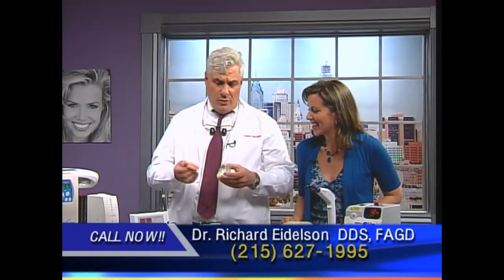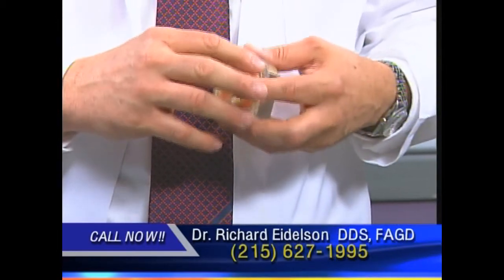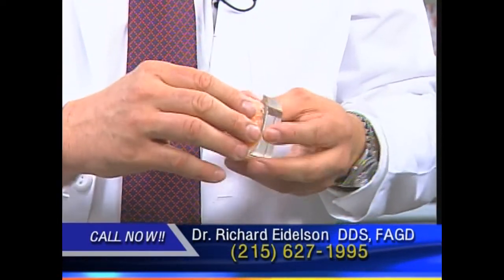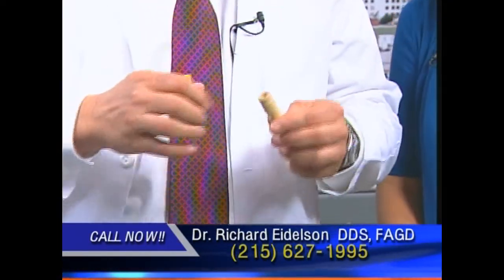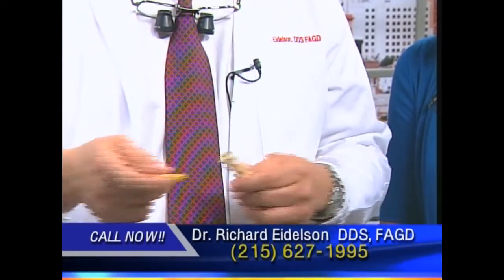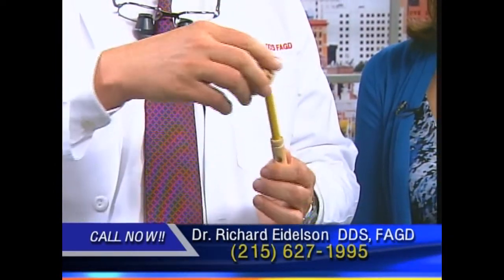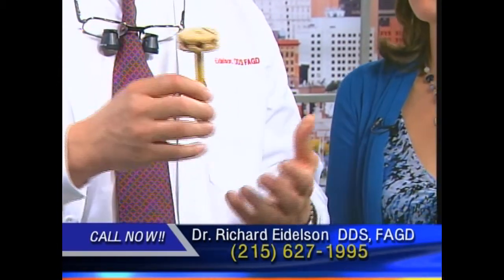Now, you have this here, and you're not going to tell me that these Tinker Toy pieces are part of your latest and greatest technology, are you? Well, we were talking about implants. It's a big part of my practice, although, once again, we use all these items to help us do great basic dentistry. So we put implants in. This is a demonstration model, and this is just one way of attaching teeth and having a secure fit. But what I like to explain to a patient in easier terms, the implant would be, this is a Tinker Toy we used to all play with. I'm a little older than you, so you might not know. You're a Lego person. So if this were the implant, we put this in, it's painless, it takes about an hour. Then we have a piece about 2 months later called the abutment, or the part that attaches to the implant, and then we put the crown or whatever item attaches. So we have the implant, the abutment, and the crown, or if it's a denture, but it's very painless, very quick.